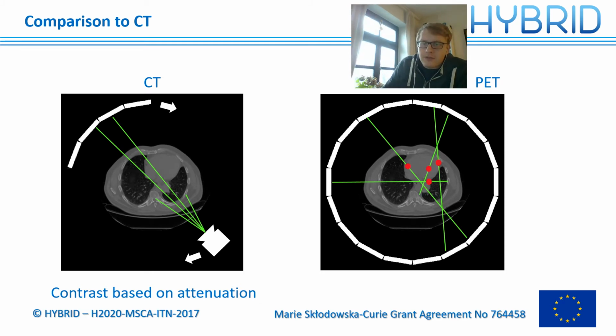So let's say we have those 4 annihilations and 8 gamma particles in the end. Then you can see, for example, in this case, we measure this particle here and this particle here. But it can also happen that some particles are absorbed. And this is why it is usually a great idea to combine those two. So to have a way of knowing how many particles will basically come out of your scanner, because here you just measure one and you don't know where the other went.